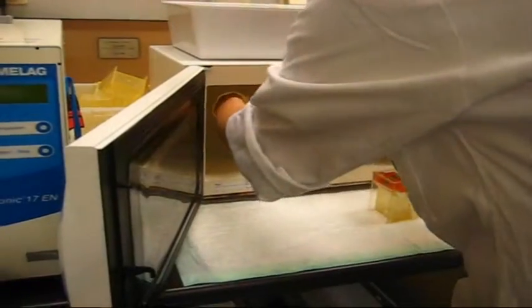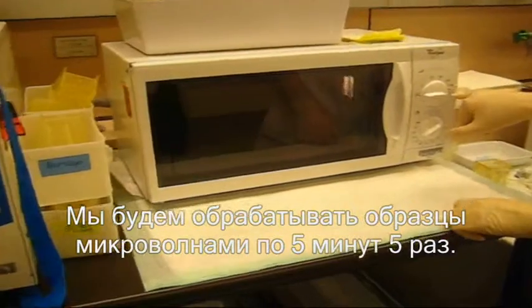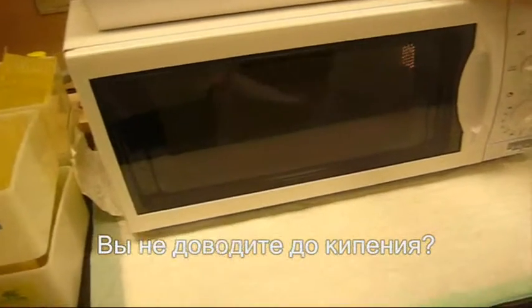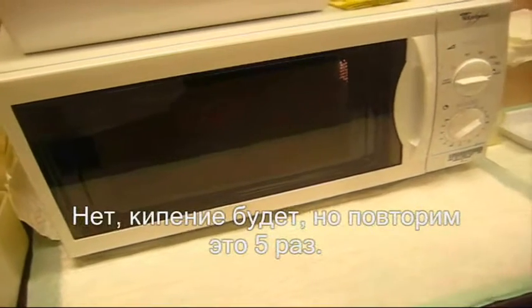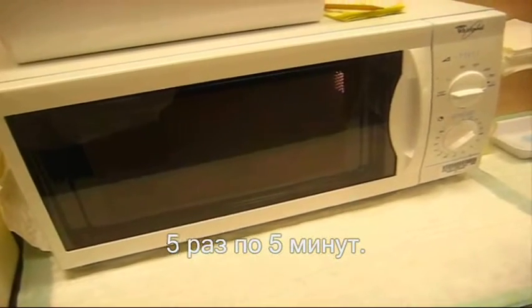We have to put it for 5 minutes — 5 times. Are you waiting for boiling? No boiling. It will boil, but we have to repeat it 5 times: 5 times, 5 minutes.